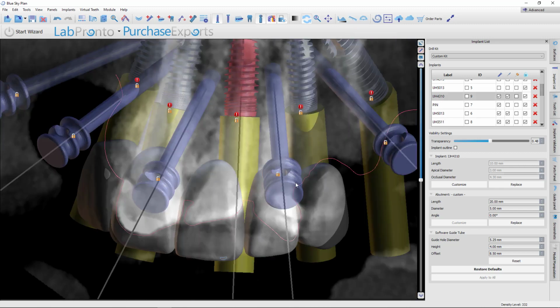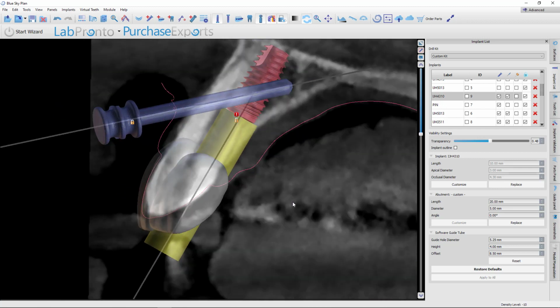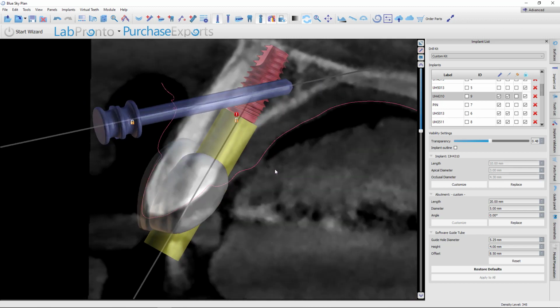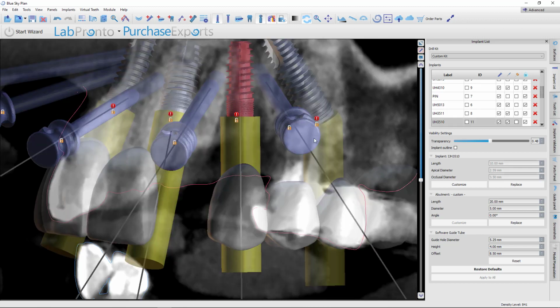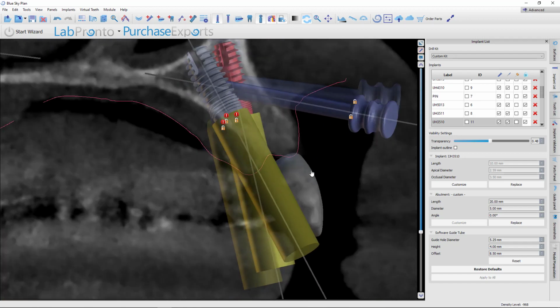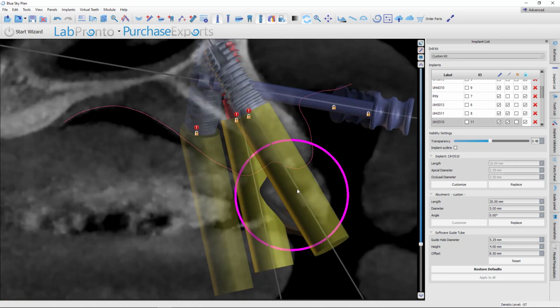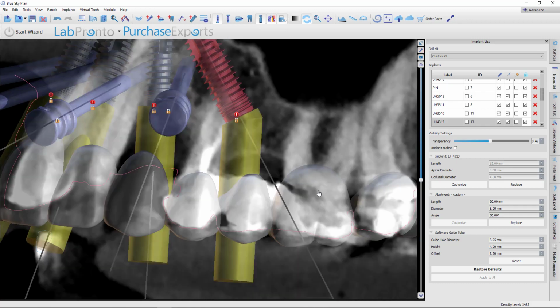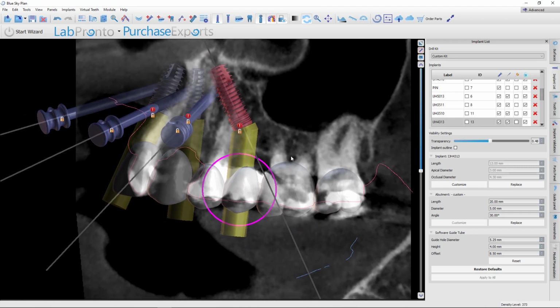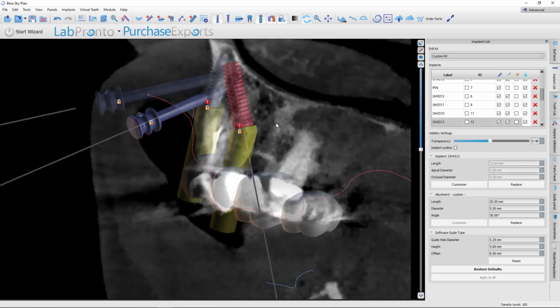And now we'll jump ahead and look at the other implants. Again, we're always trying to come in the anterior lingual to that incisal edge, preferably somewhere in the cingulum to get the best emergence profile. This is patient's left side in the canine region, again, lingual to the incisal edge, and then finally the patient left side disto-angulated implant. So this is going to emerge through the second premolar after it's had a 30-degree abutment put on.